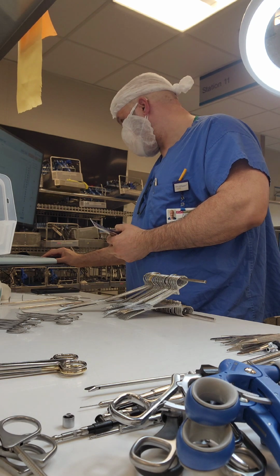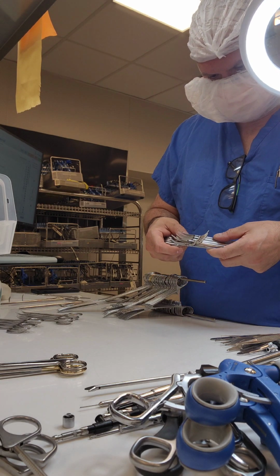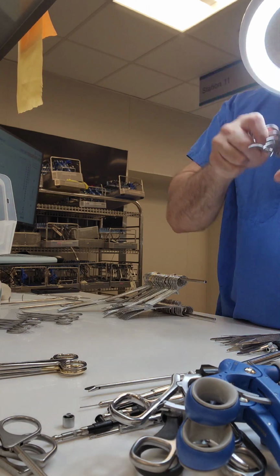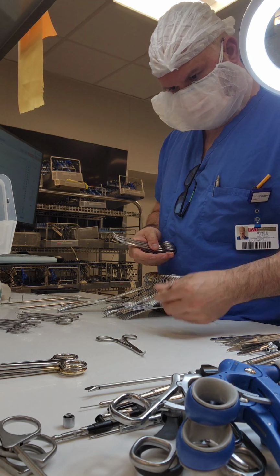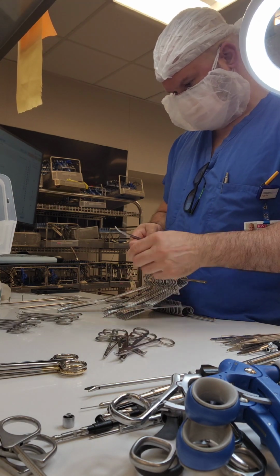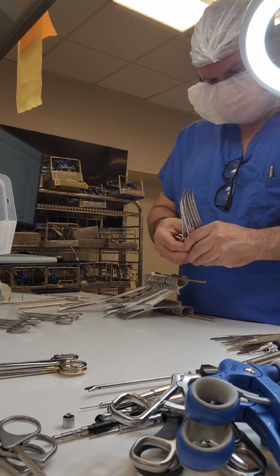Answering a couple questions, people asking you for help, all that takes time. You'll also see at the end of the video that I wind up grabbing the wrong size basket, thinking that this was a longer laparoscopic tray when it required a shorter basket. All those are wasted movements and could have been planned ahead to minimize, but it's all part of our daily assembly, right? This is what happens in real time. What we put down on paper sounds great. What we learn in the book sounds great. But this is actual assembly on the field, right? You see how I tap test, and now when I tap test, I have to open those instruments up to put them on a stringer, right?